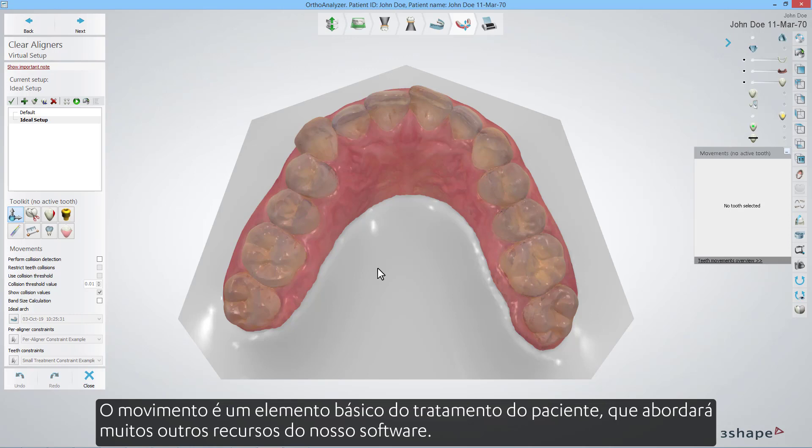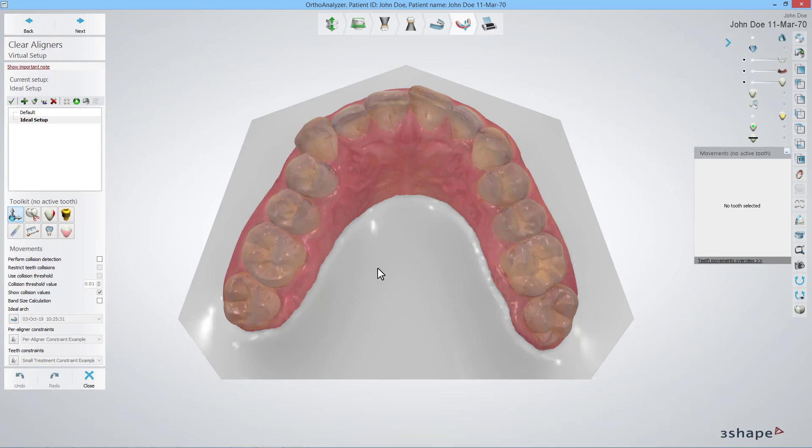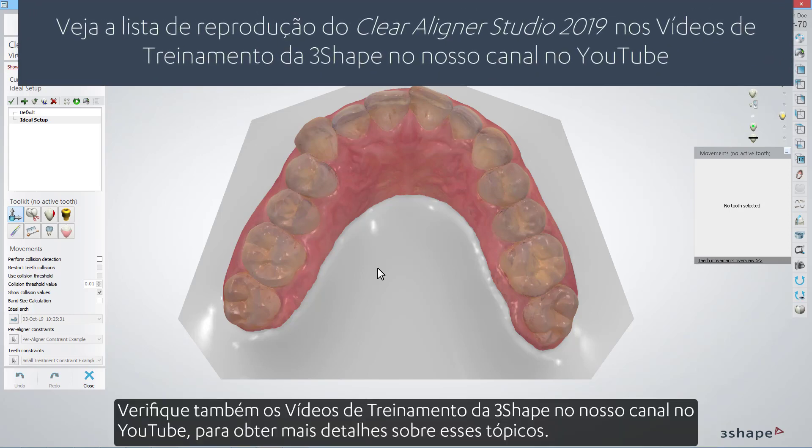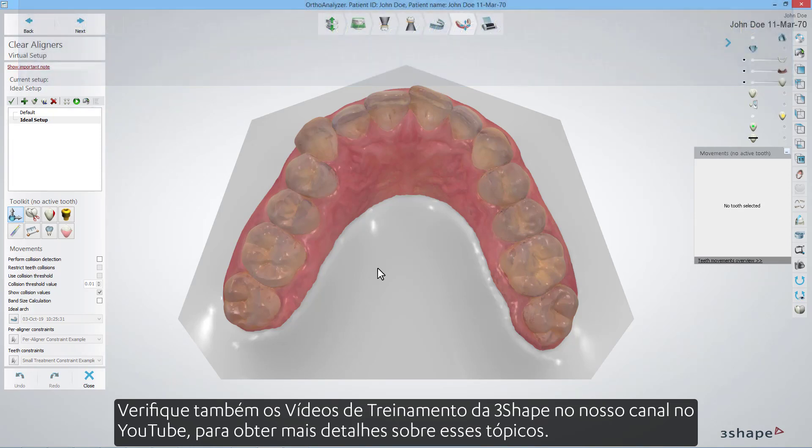Movement is an elementary element of the patient's treatment that will touch upon many other features of our software. Please make sure to check out the videos on our 3Shape Training Videos YouTube channel as well for further details on those topics.